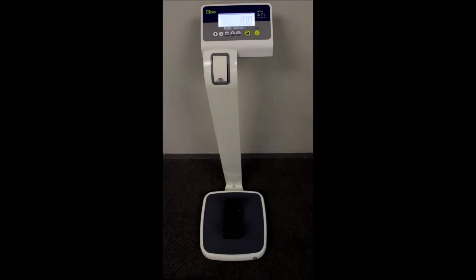It also has a height measurement which is located over here. It has an automatic on and off. It has a hold function that will hold the weight for 10 seconds after the platform has been emptied.